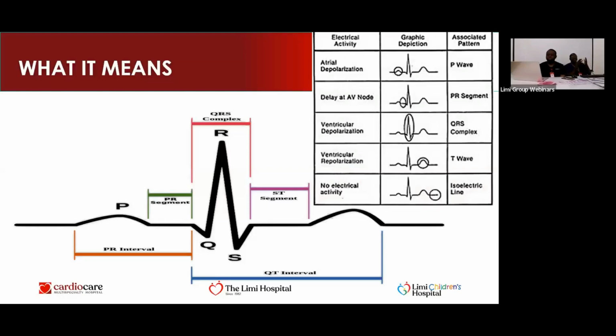What it stands for is atrial depolarization. Or if we don't say it simply, atrial contraction. But the right word to use is atrial depolarization. That is this first bump.